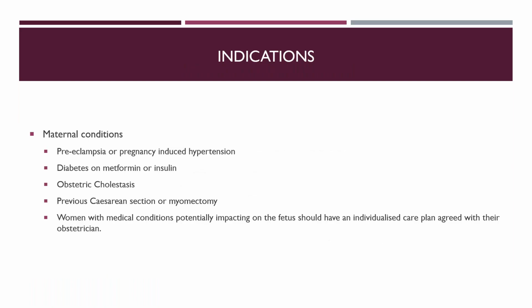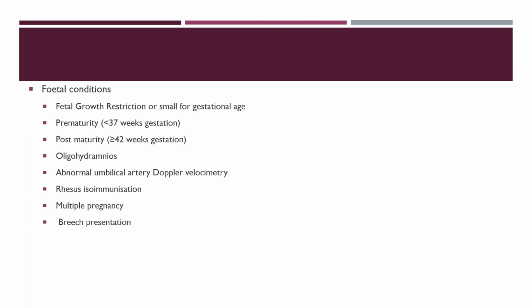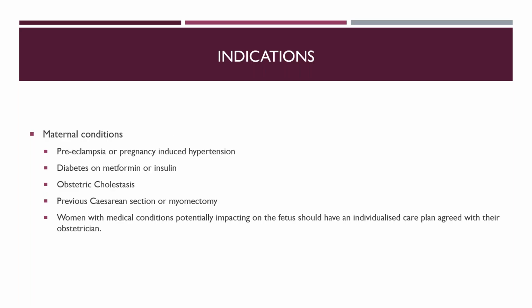Normally we don't do CTG in every case. We only do CTGs where there is some kind of risk. So what are the indications where we do the CTG? It can be a maternal or a fetal condition. In the case of maternal, if there is any kind of maternal medical disease, we do the CTG.